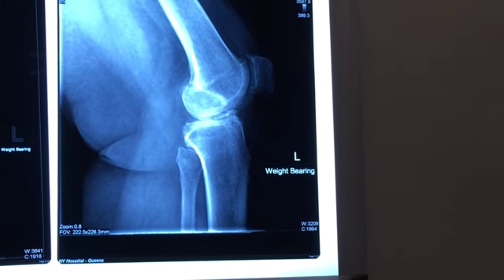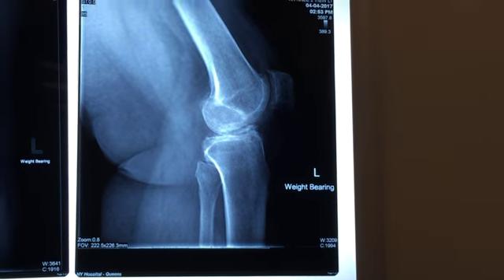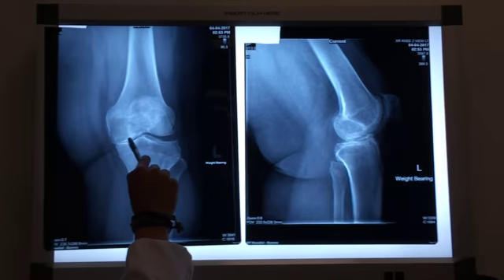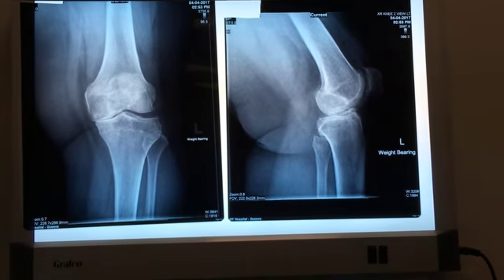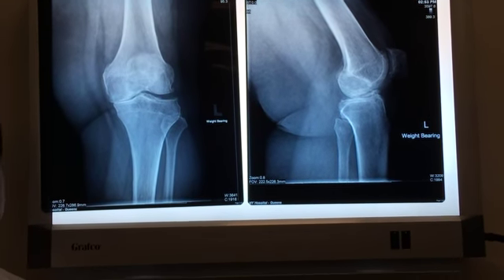But the technologist took the image because the patient was in pain, and we weren't going to be able to fix this again. So as you can see here, there's some type of pathology that exists here. And when I got the lab report, the doctor said that yes, she was going in for a complete knee replacement because she had severe osteoarthritis.